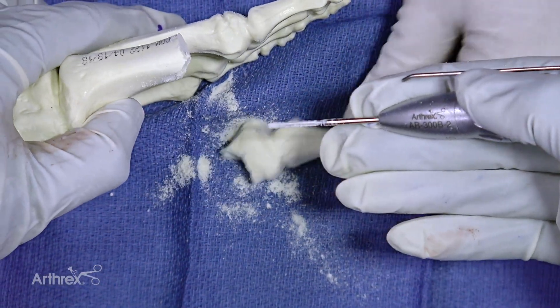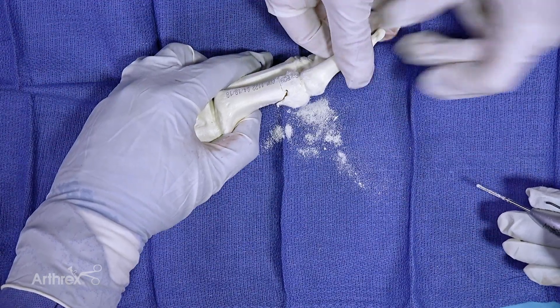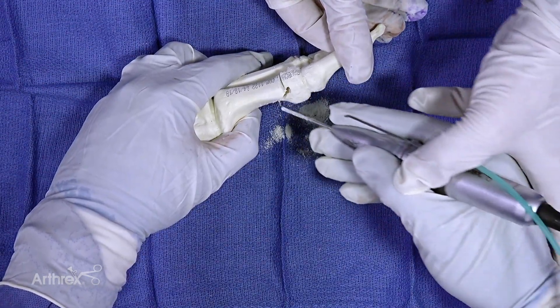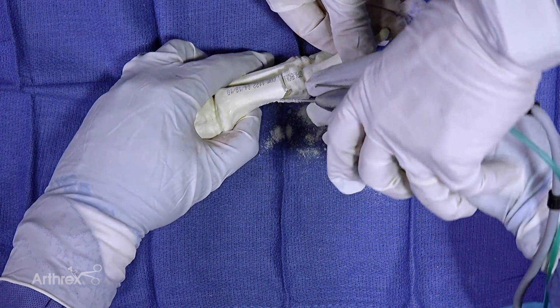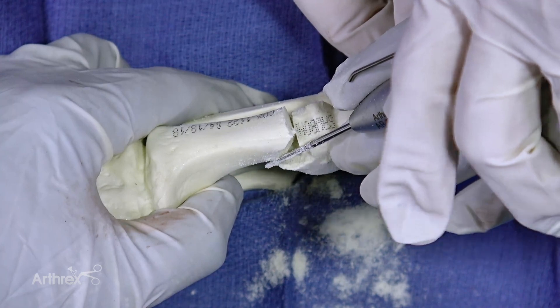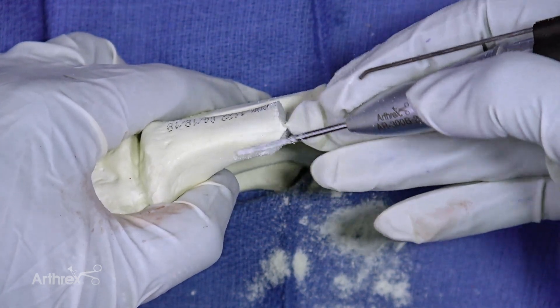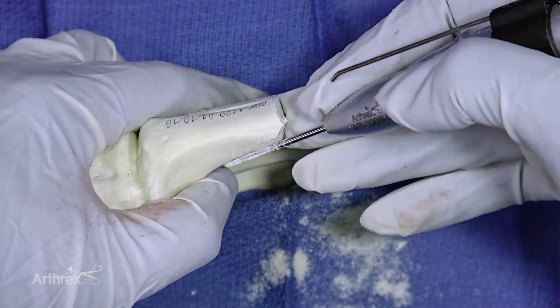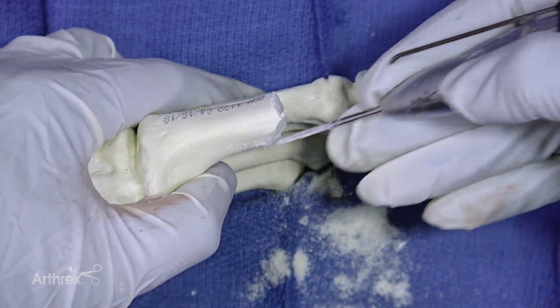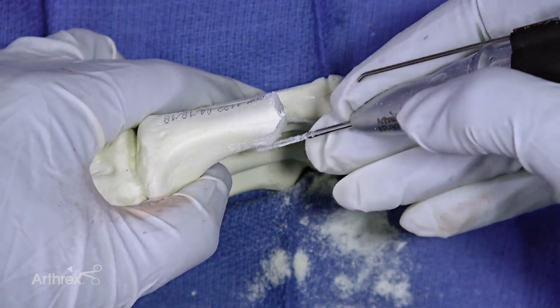You can see it's a shallow chevron cut just like we planned. It's important to note that as you're rotating, this hand almost ends up superior to your phalanx as you're coming up and over to complete the cut. If you come too horizontal or too parallel with the phalanx, then you'll make a very long plantar limb of your chevron, and that's going to be much harder to displace because we're not doing any soft tissue stripping here.